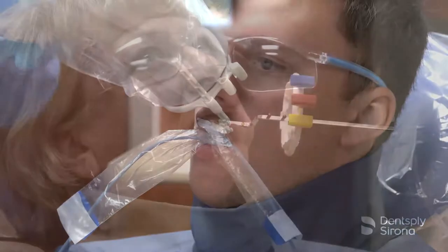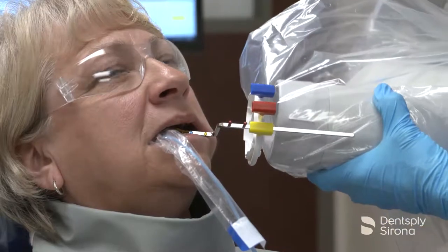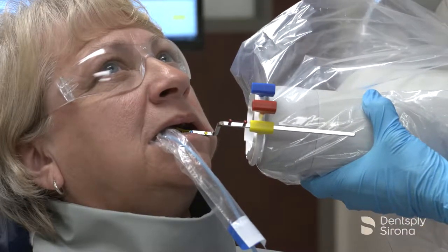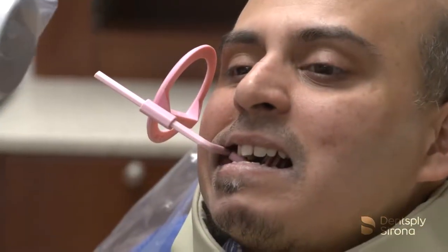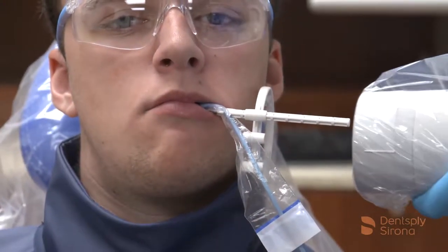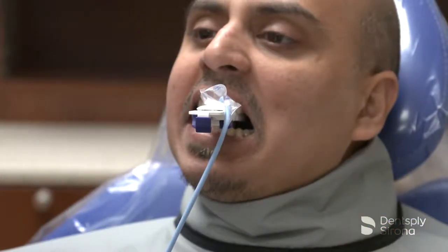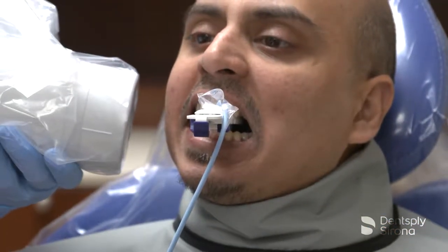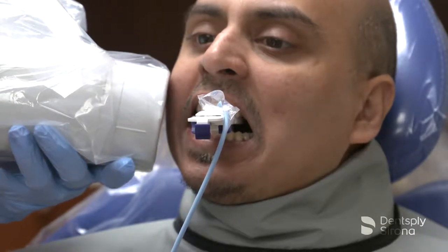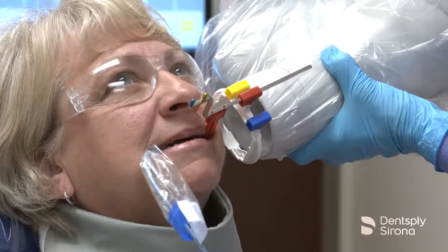Dental radiographs are valued diagnostic tools when the image quality is adequate enough for proper interpretation. To do this, it is imperative to correctly place the image receptor in the mouth and ensure that the primary x-ray beam is centered and aligned correctly in both the vertical and horizontal angulations. It is crucial to minimize patient exposure to radiation. Successful images require the use of careful technique and precautions to maximize their diagnostic and interpretive value.